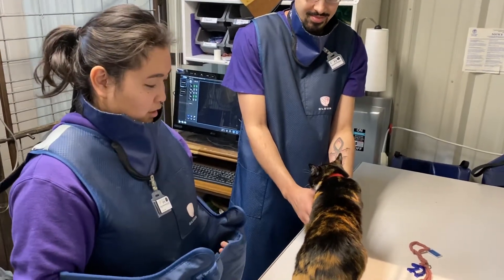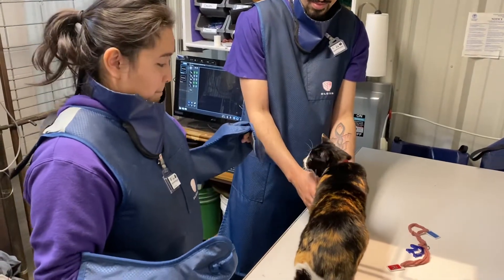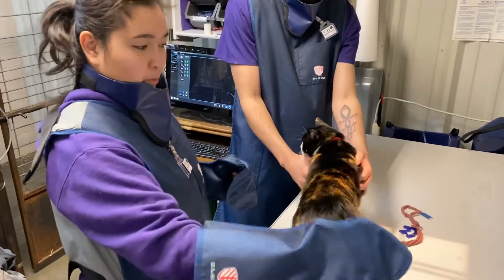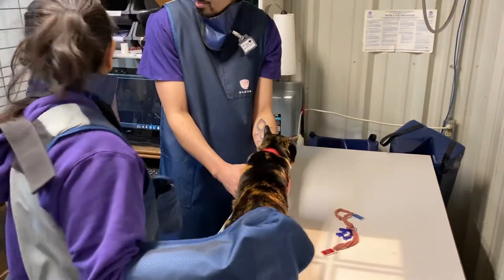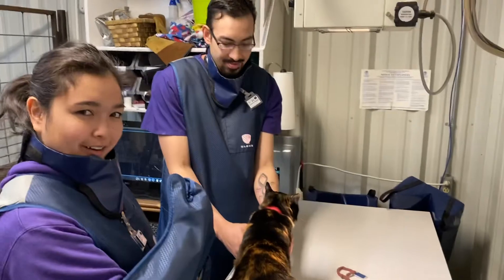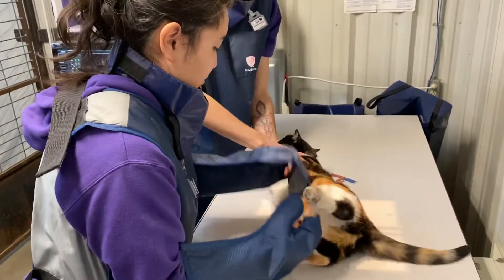I'm going to be taking a lateral thorax of Patsy here. I'm already set up with everything on the machine - the KVP and the MAS is all set. Devon's here to help me control her because she's a little bit wiggly, so we're going to go ahead and flip her on her side.